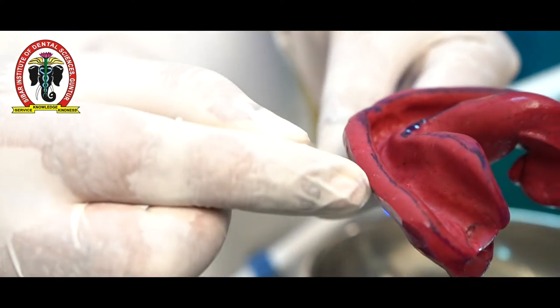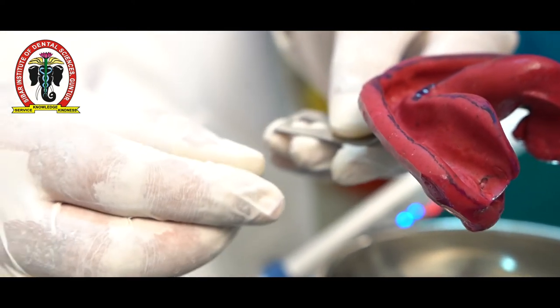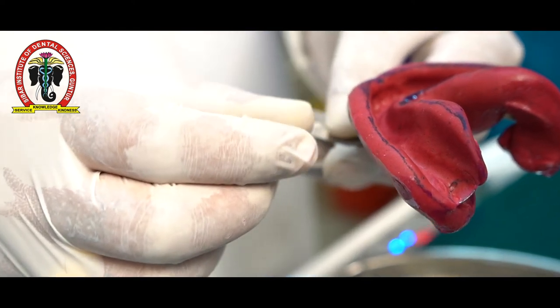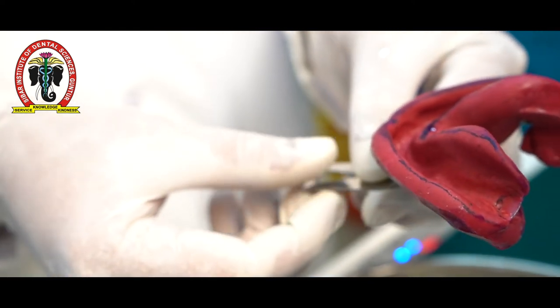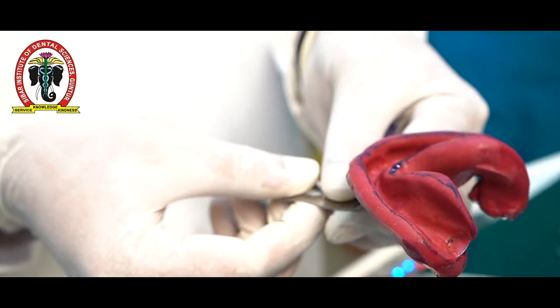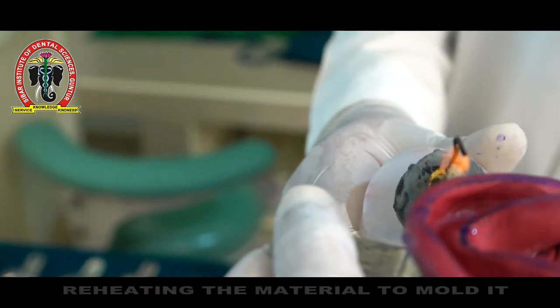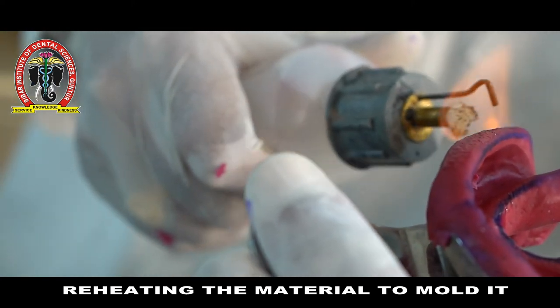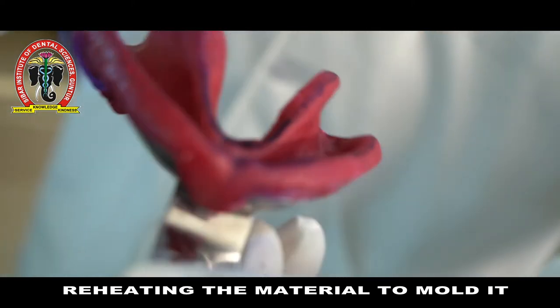The labial flange and buccal flange area excess has been removed using a BP knife. Then use a blowtorch or alcohol torch, flame it, and temper the material. Dip it in warm water, then once again place it in the patient's mouth and perform the necessary movements to refine these borders.